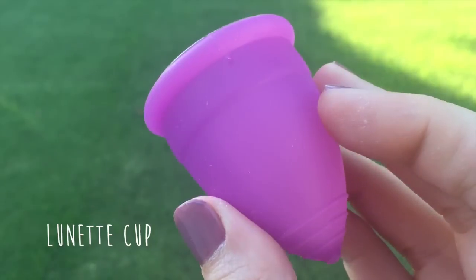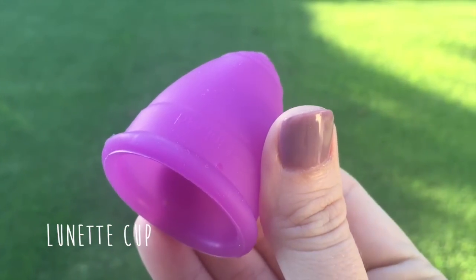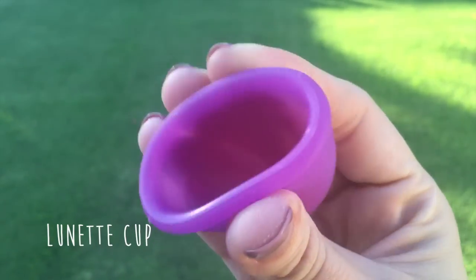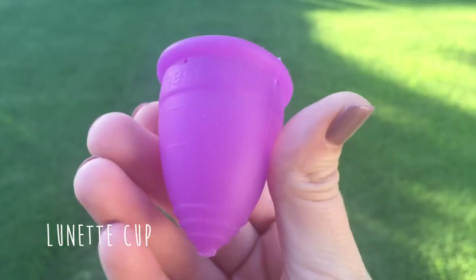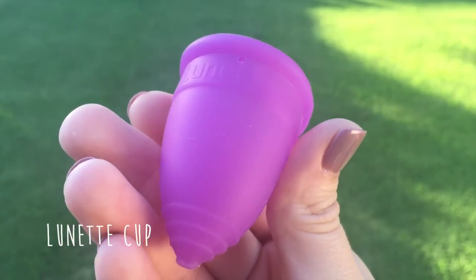Now we have the Lunette Cup size 2, made in Finland. It is also made of medical grade silicone. I have it in the color violet. It has a diameter of 46 millimeters, a length of 52 millimeters, and a capacity of 30 milliliters.